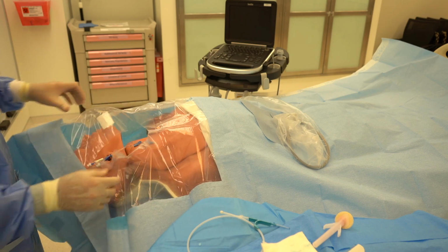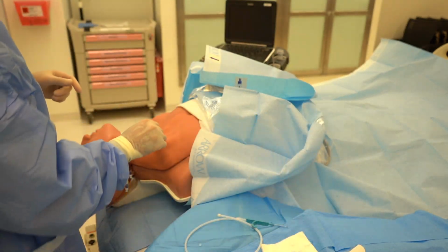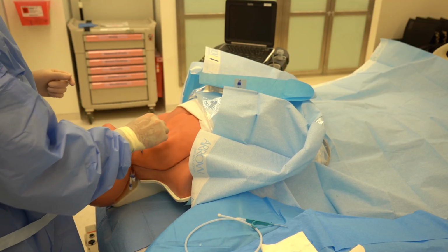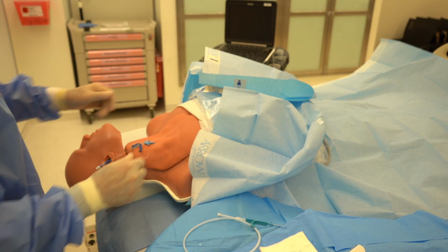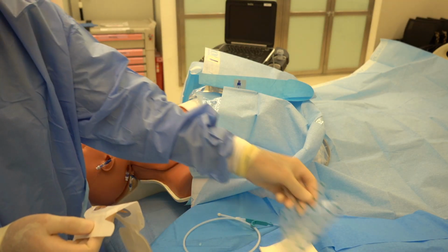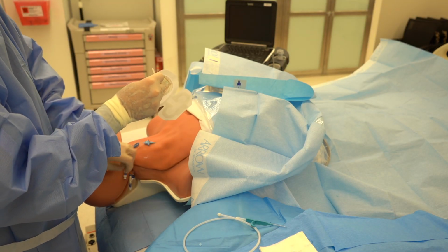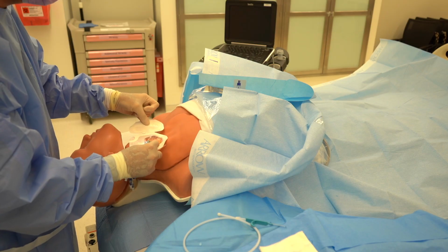we'll remove our drape very carefully. We'll grab some fresh chlorhexidine, non-tinted typically, to re-sterilize and clean off our area. While that's drying, we may be able to tend to some of our sharps and dispose of those, but upon dry time of our chlorhexidine, we'll take our chlorhexidine impregnated tegaderm and place that over our site to assure that the insertion site is in the center of that chlorhexidine gel.